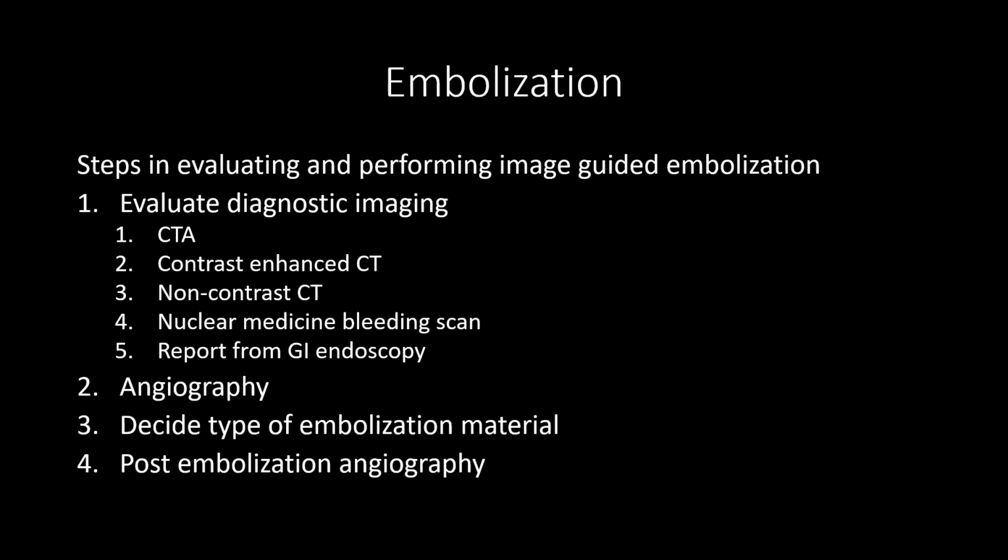So typically people come with pre-procedure imaging and kind of what's the order of things that we would like, or what's the order of our preference. Number one, the best way to look for bleeding would be a CT angiogram. So CTAs, especially for bleeding protocols, the images are obtained while there's contrast in the arteries, and then usually people get a venous phase and then a delayed phase.